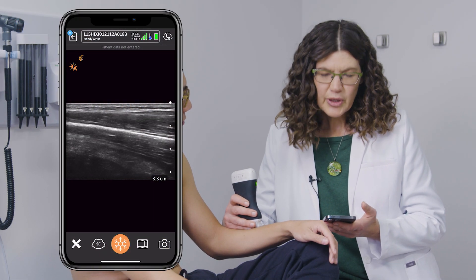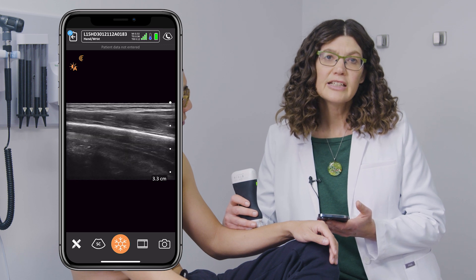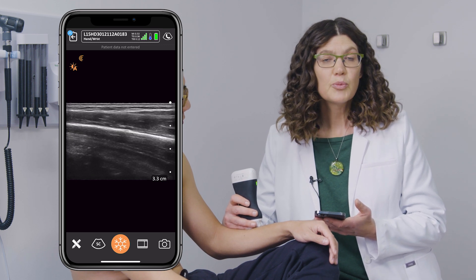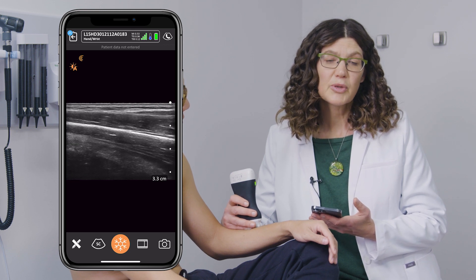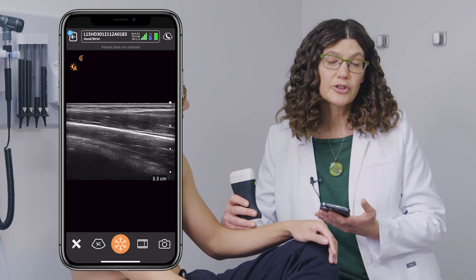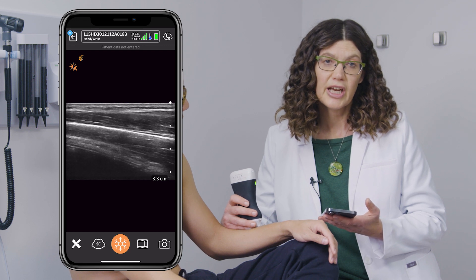Using the linear probe, we can evaluate the radius for any type of fractures. This can be super helpful in the emergency room when you don't have availability of x-ray or in the clinic, especially with children, who it's difficult to differentiate whether they have a sprain or a fracture.